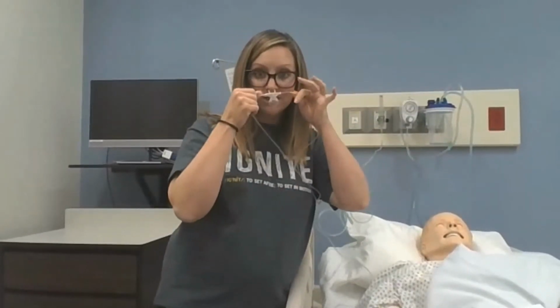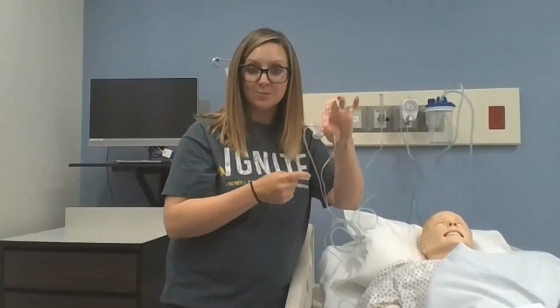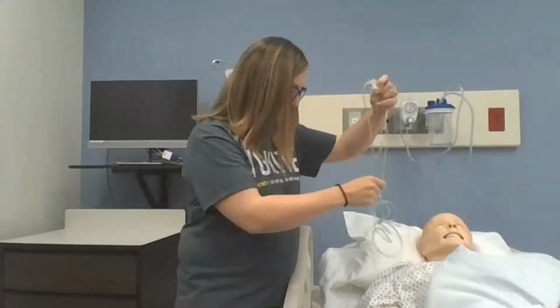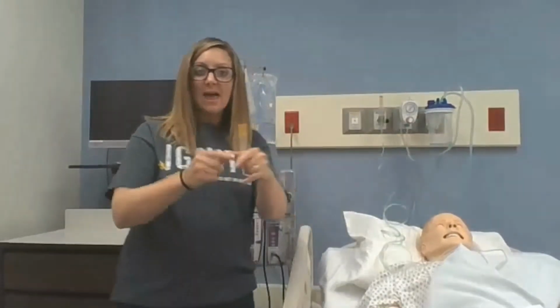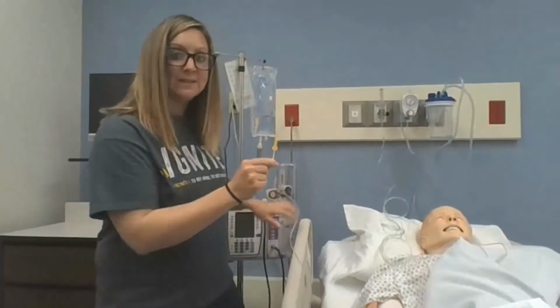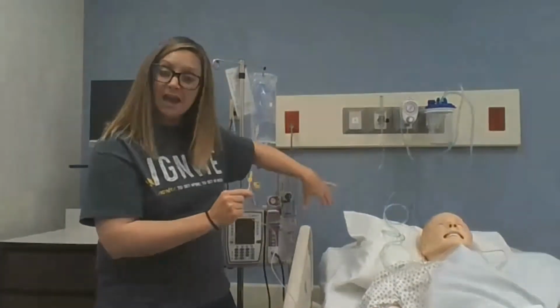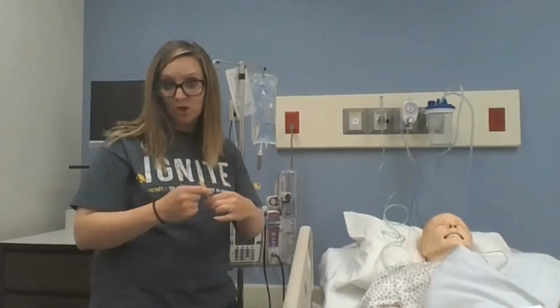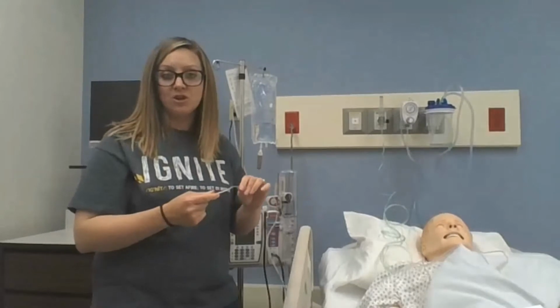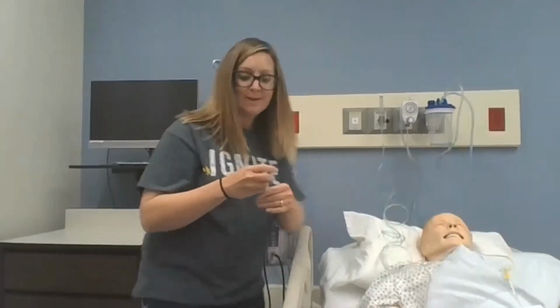So when the patients wear this in the nares, it's got this little flap that measures their respiratory rate and CO2 values, and it's got this kind of little Y off. And this hook will actually go into a separate chamber that goes on the outside of the PCA. It'll be a yellow chamber that you would connect this to, and that actually is their CO2 monitor. So it's going to measure their CO2 in addition to their respiratory rate to make sure we're in safe parameters.